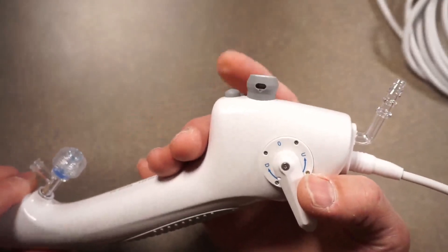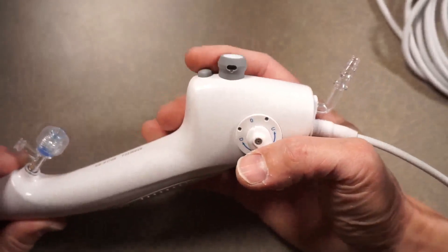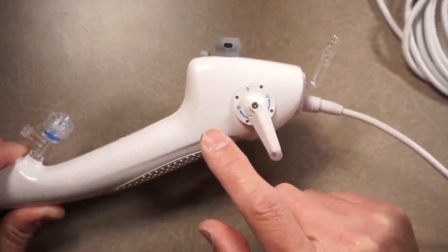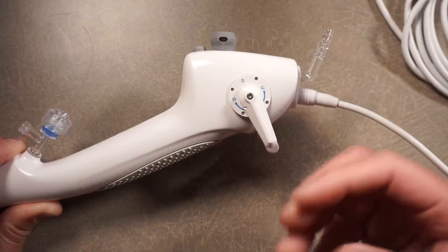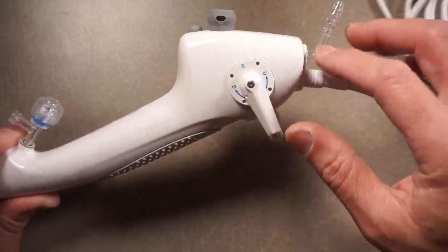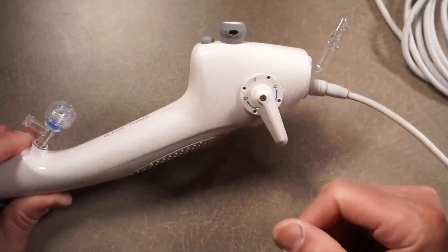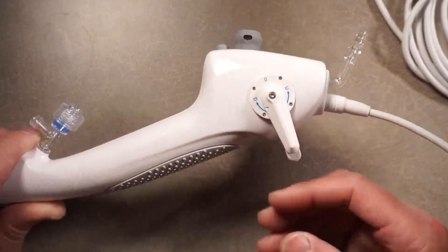This button up here — I don't know if you can program it — but when I press it, it actually takes a picture of whatever image is being shown on the camera at the distal end. It captures it into the processor, and from the processor you can save it onto a USB. So we talked about the suction, the suction button, and the button for still image capture. I don't know if you can program it to do other things.